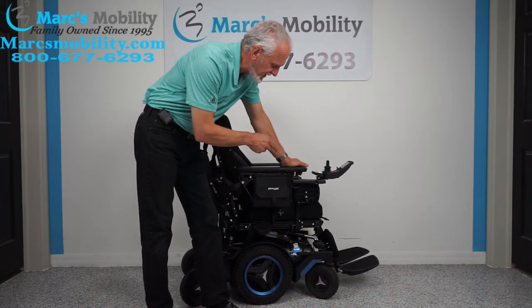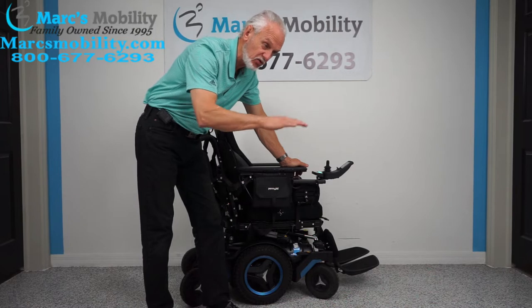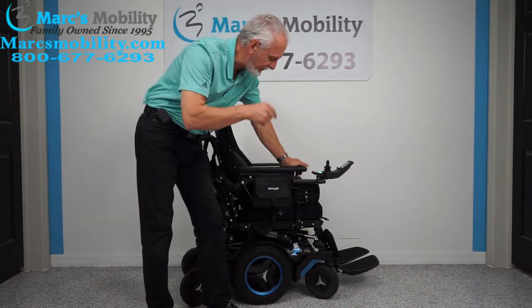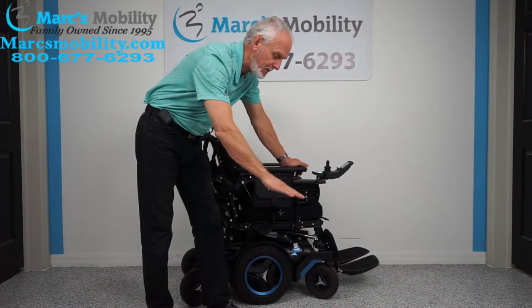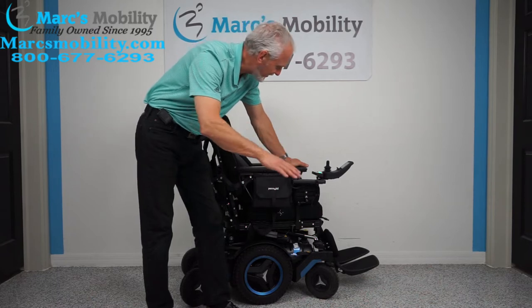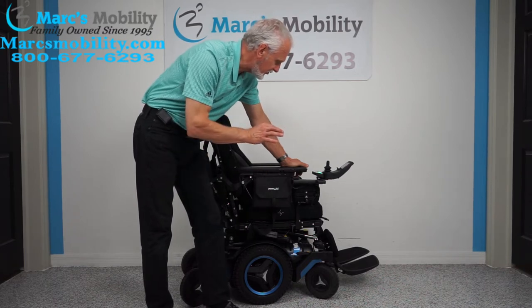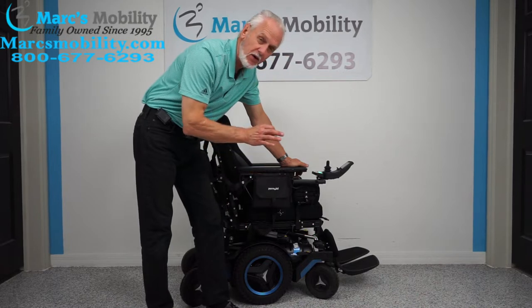This chair also has a seat lift that goes up to 14 inches — most chairs only go up to 10 or 12, but this one goes up to 14 inches. Those are the two main benefits of the M5: the high speed motors up to 7.5 miles an hour, and the seat lift going up to 14 inches in height. That extra 2 inches makes a big difference.